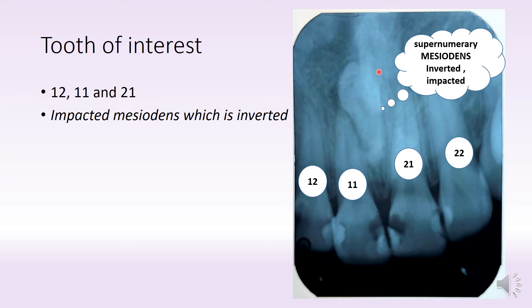and it's not only impacted but it's also inverted in position, where you can see from this image here that the crown is placed close to the apex of the teeth and the roots are facing the other way around. So this tooth is actually an impacted, inverted mesiodents.